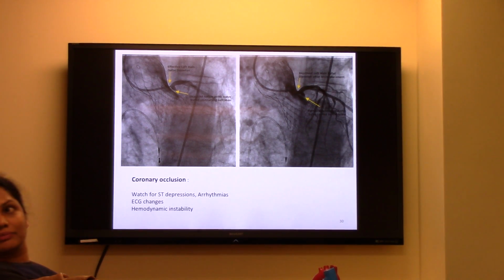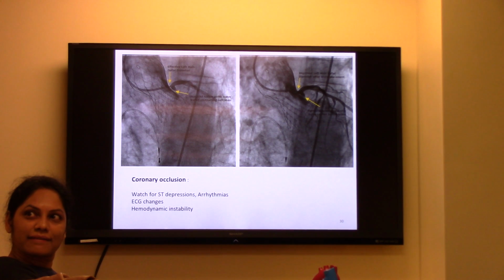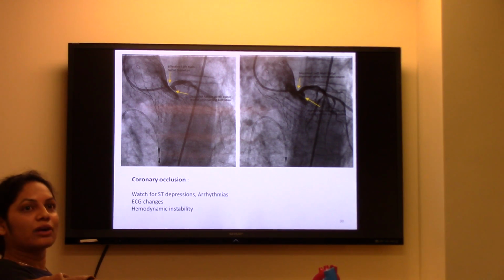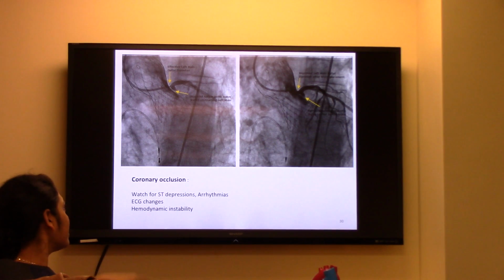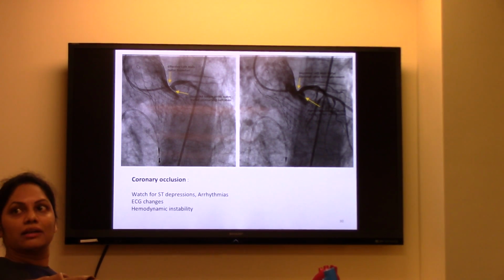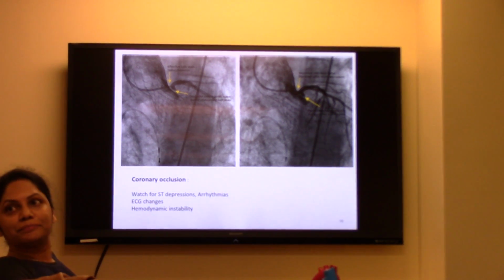How do you determine which patient population gets radial access from the start? Is it the CAT scan and the proximity? Yes, the coronary height from the aortic valve. If it is lower, especially women tend to have lower heights, they get it. How about people with disease in that artery, does that put them necessarily at more risk?